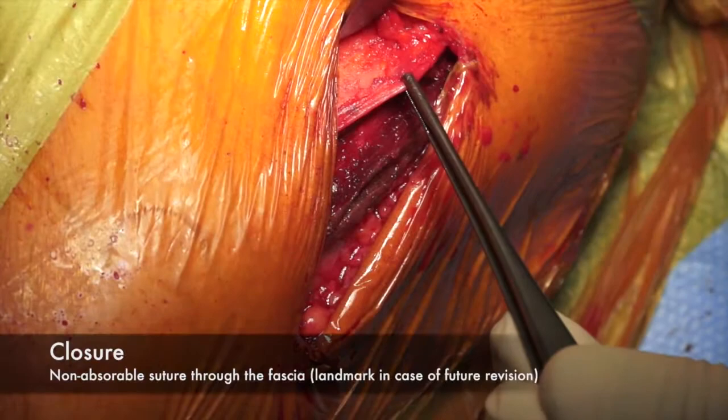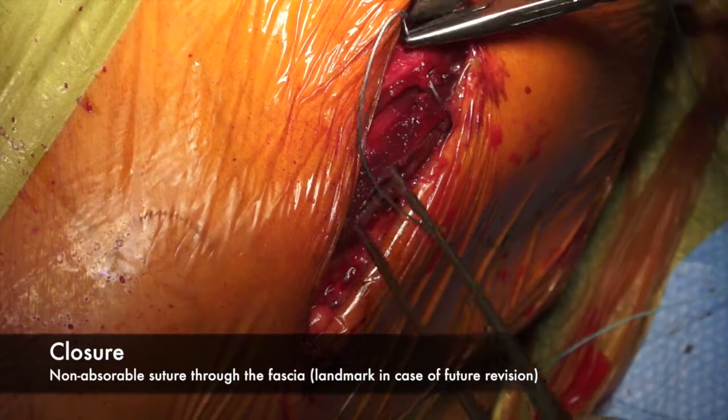Closure. Non-absorbable suture through the fascia. Landmark in case of future revision.